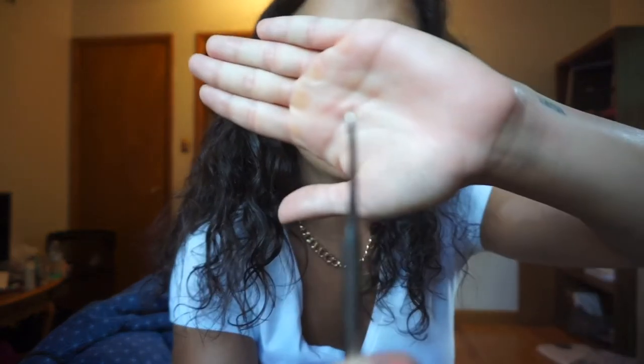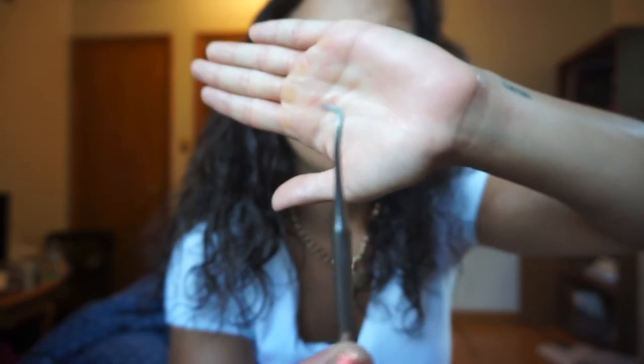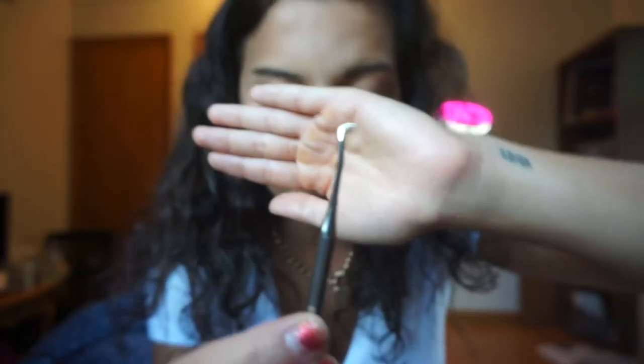Next is a scaler. It looks very similar to the explorer but it's thicker. Orthodontists will use this to clean a little bit in between teeth — not like a hygienist, just minor cleaning. We also use it to clean cement off the back teeth when we take bands off, and to get spacers out.